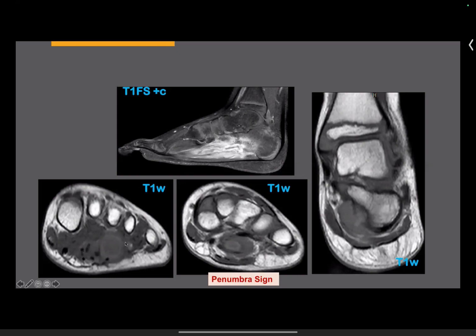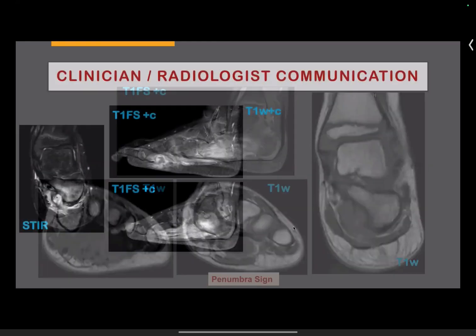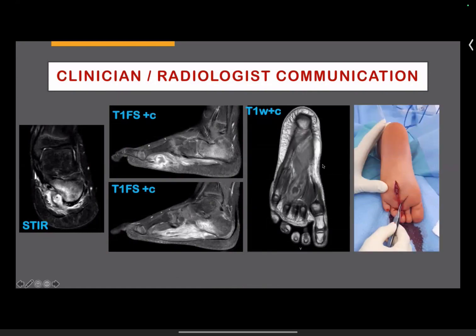So this was, again, unexpected. So we communicated to the clinician, we did the MR, and next day he went to theater and they took it out. Obviously, he needed antibiotics for 6 weeks, and he did well afterwards. So again, it's important that when you see something unexpected, just think a bit outside the box, or what can go wrong.